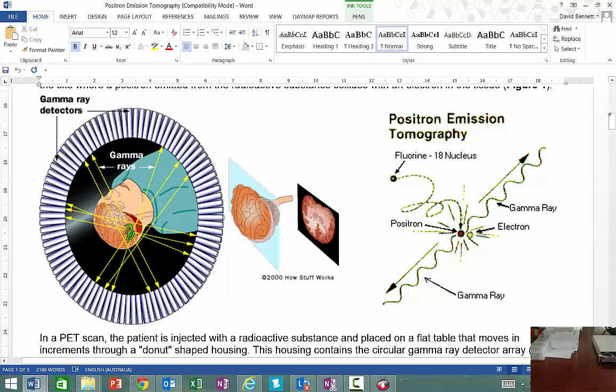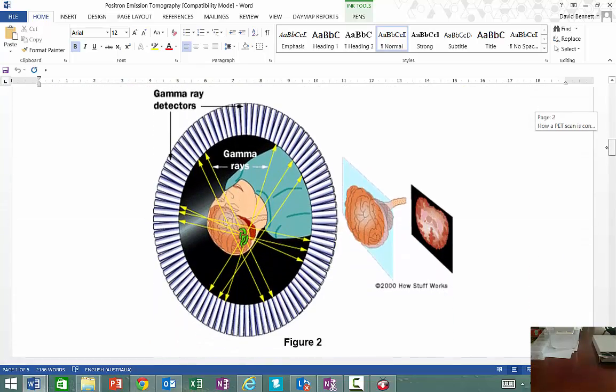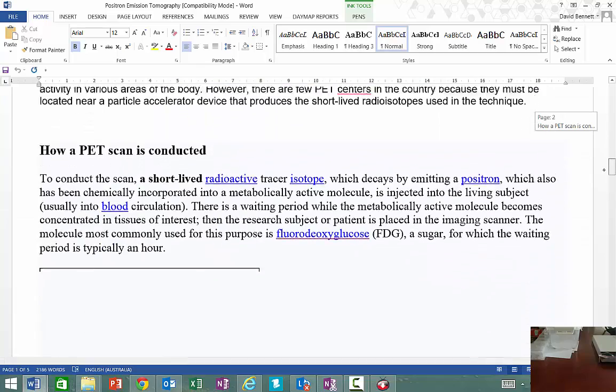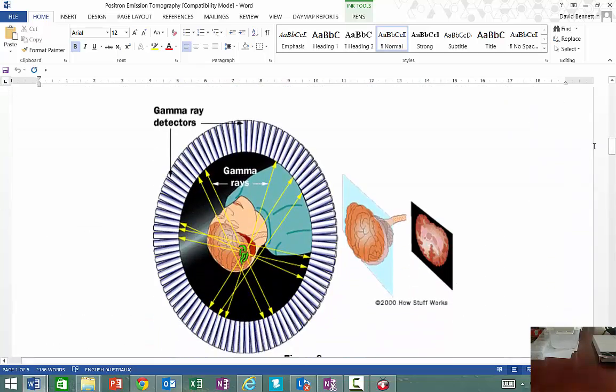Now the new thing with PET scanners is they use them with other things like MRIs or CAT scans and so on. They found that's actually a better way of looking at the information. Alright, so the 3D image of that is actually quite amazing when you start looking at how the detector works. And that's certainly been a really, really positive source of detecting cancer in humans.